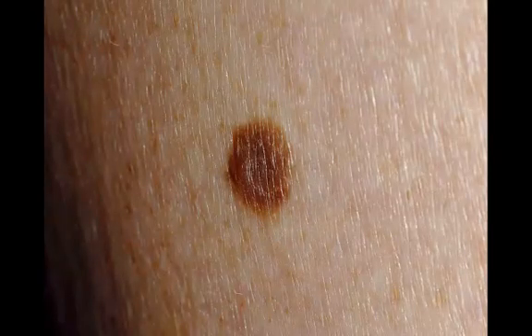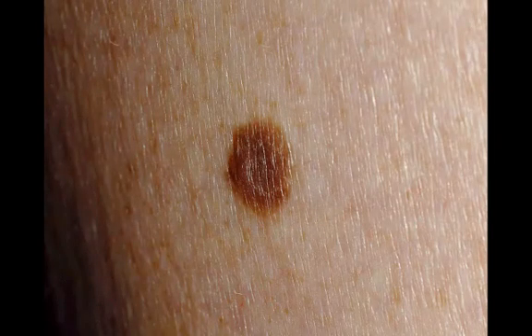Another lesion clinically. Close-up — it's a flat, small, oval, brown lesion. Dermatoscopy: no chaos. One pattern — reticular lines. Practically one color. We do not even look for clues. It's a nevus. It's benign.